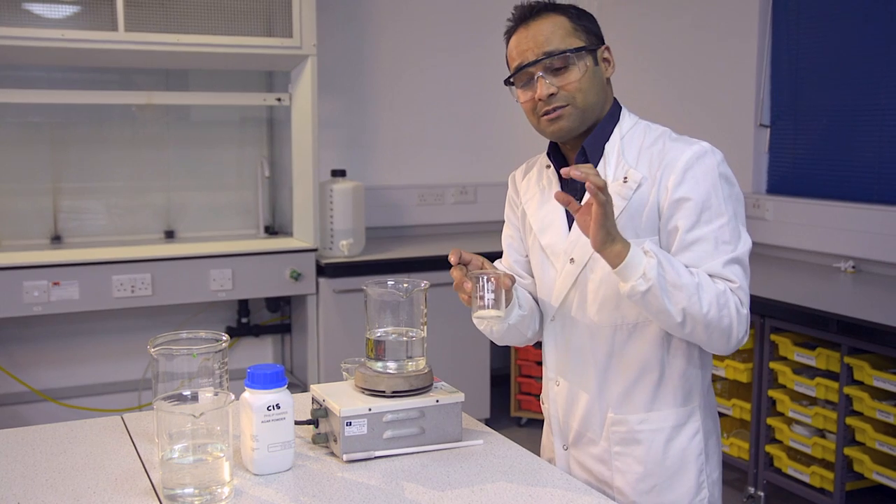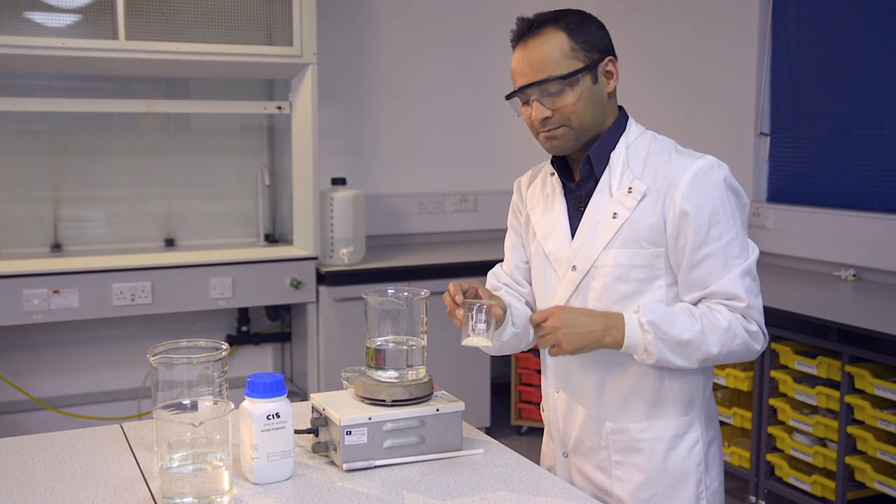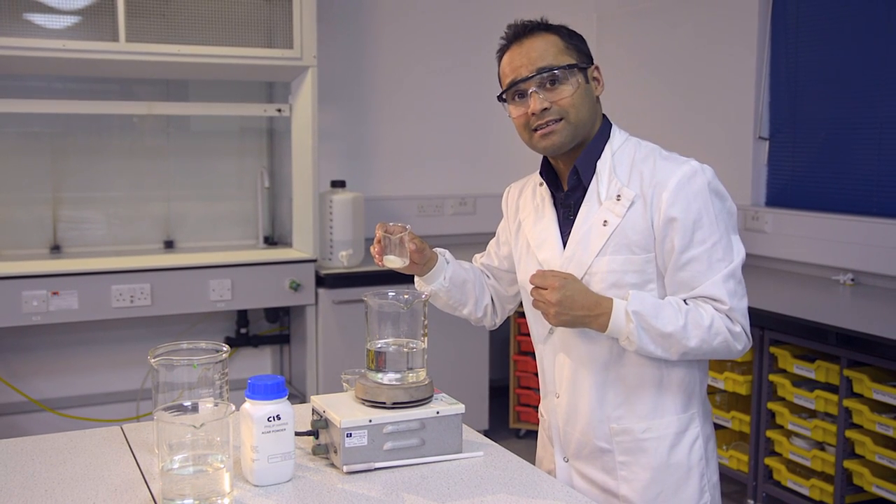It's important to note that you're using plain agar, not the nutrient agar that you may be familiar with. It's also a good idea to sprinkle the agar in gently, otherwise it has a tendency to clump together.